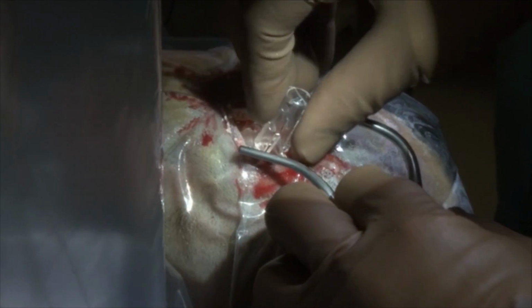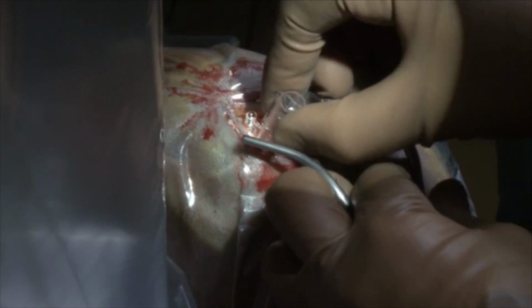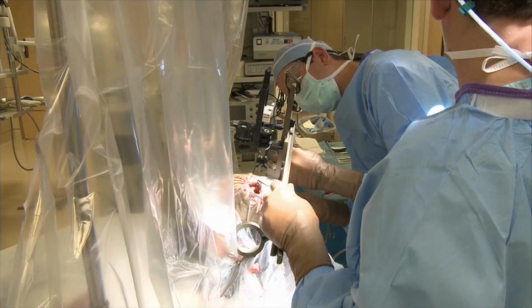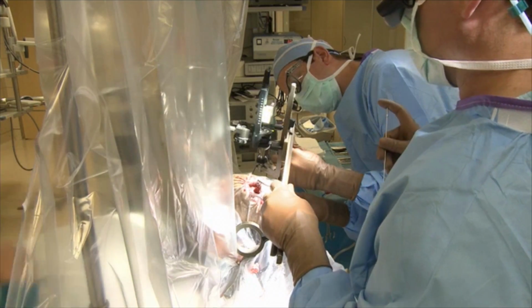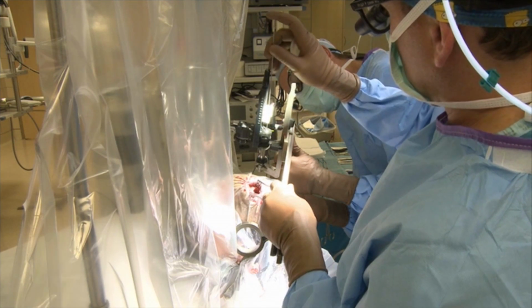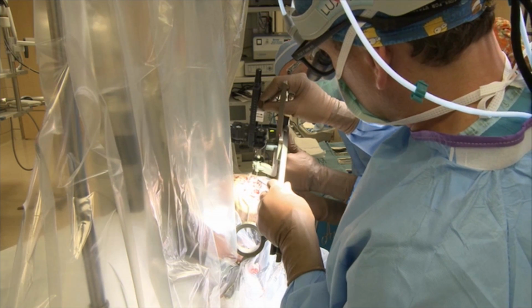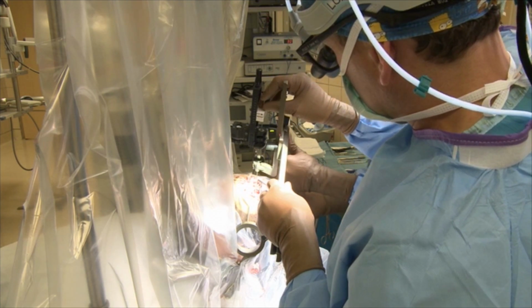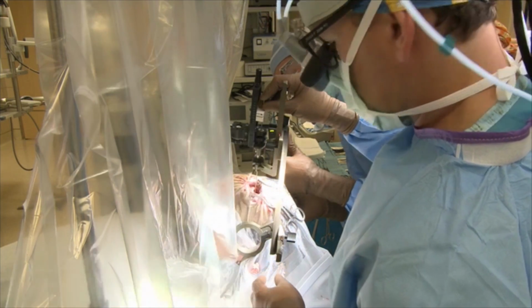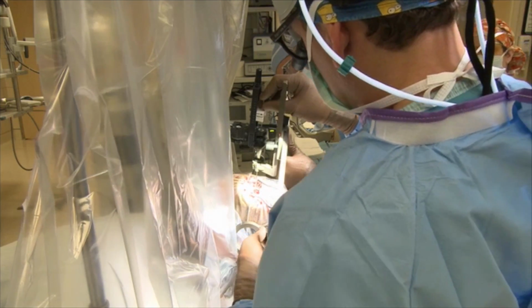This is called the Stim Lock cap, and it basically locks that electrode into place once we have it precisely located within the brain. Here, this is the Leksell arc again, and this has what we call a microdriver attached to it, and that's the black thing just beneath my hand there. Right now I'm placing the cannula down through, making sure that it's going to go precisely through the hole that we've created and through the very exact part of the brain that I would like to enter with the electrode.